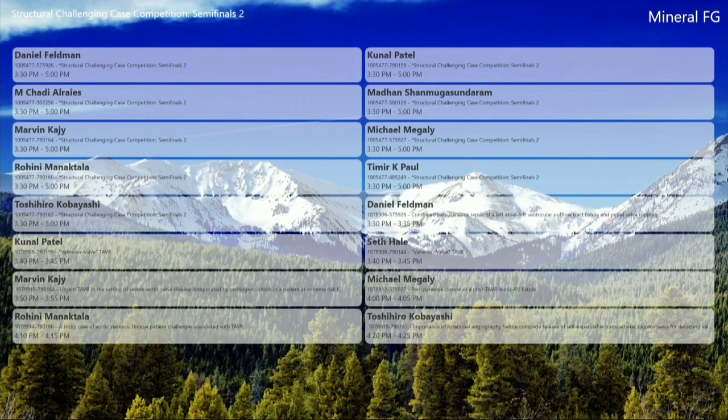Yeah, I mean, from the best of our knowledge, this was new at this presentation, but I guess you could have tried just doing the MitraClip and seeing how she did, and then do the fistula. I think we were just trying to do both at one time to kind of spare her from multiple procedures.